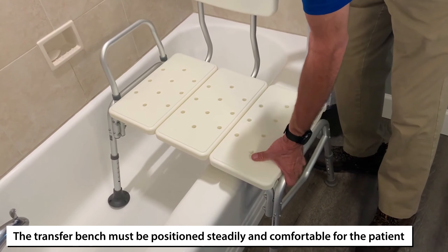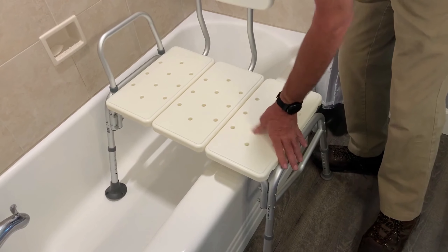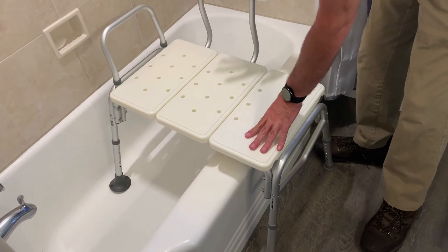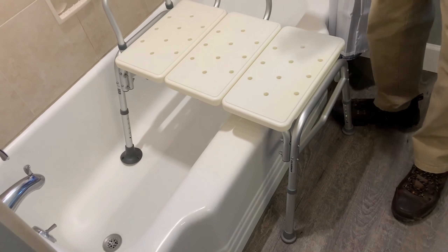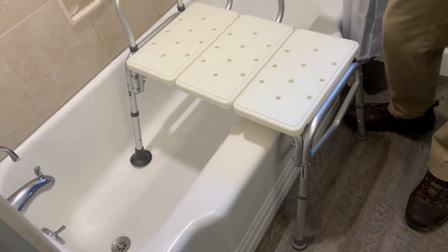The final step is to position the transfer bench in the tub so it's steady and comfortable for the patient. You want to get it as close as you can without sticking out too far, so it stays steady and allows an easy transfer for the patient in and out.